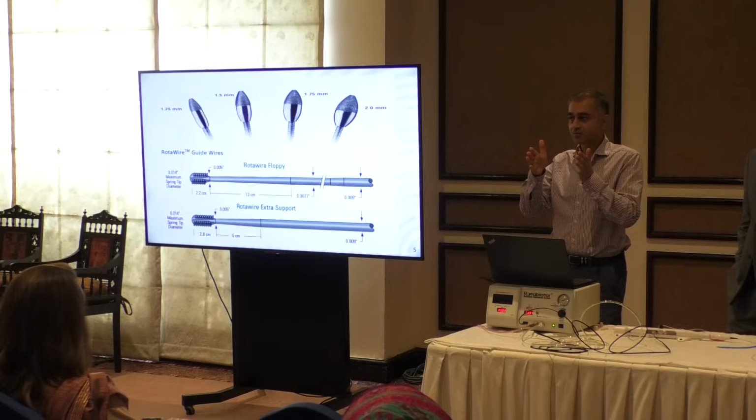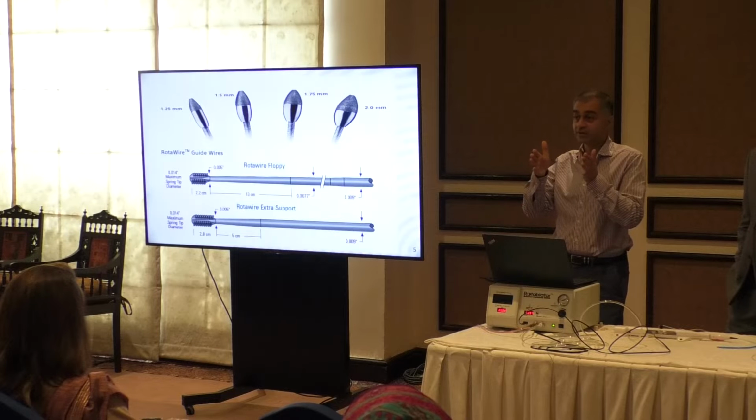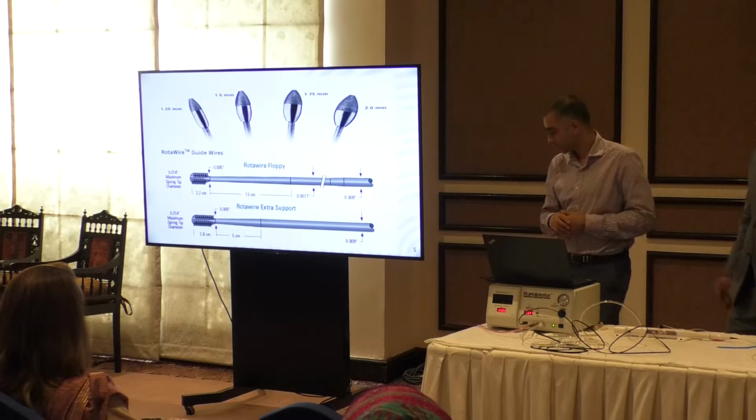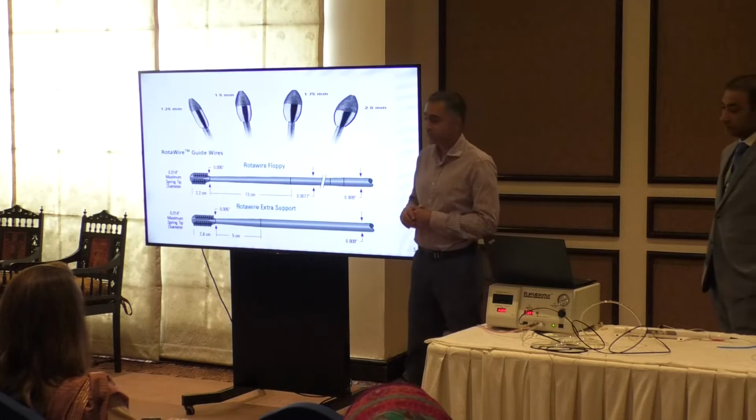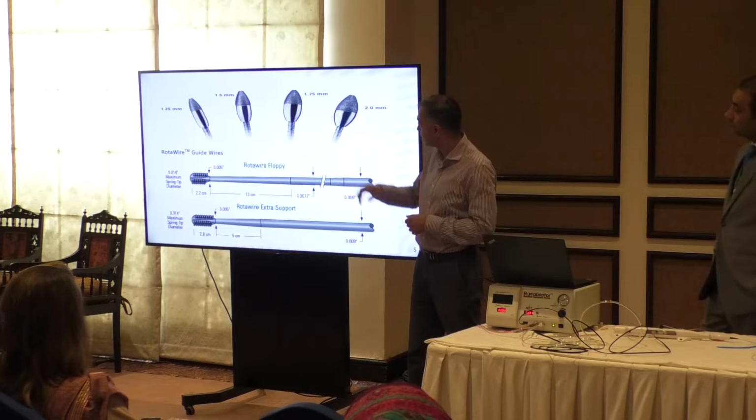And why is that important? Because one of the risks of burring, if you don't do it properly, is that you can get your burr entrapped in the lesion. Okay? And if that happens, then I'm afraid you're in big trouble. So what you need to do is try and avoid that scenario occurring.